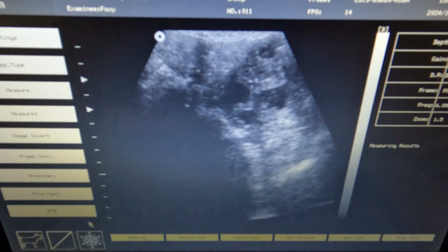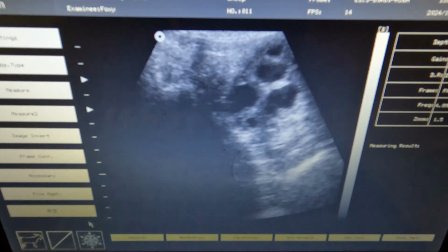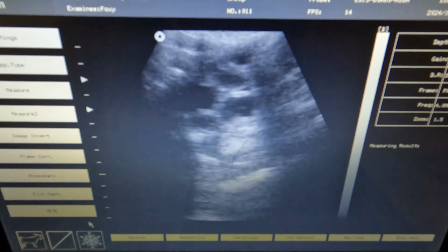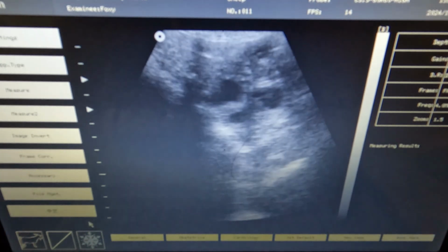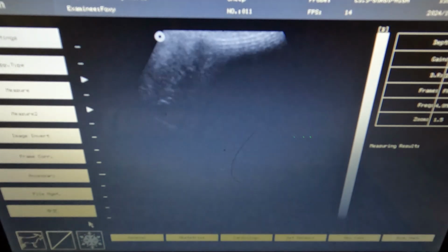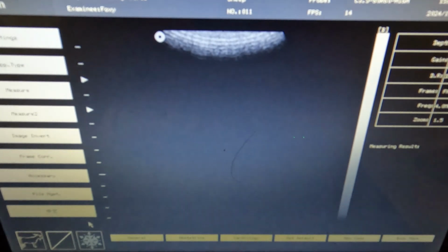Come on, let's get some bouncing babies. We can count them. I think there is a 3rd one in there. I'm going to write 2 to 3, but that really did kind of look like a 3rd.